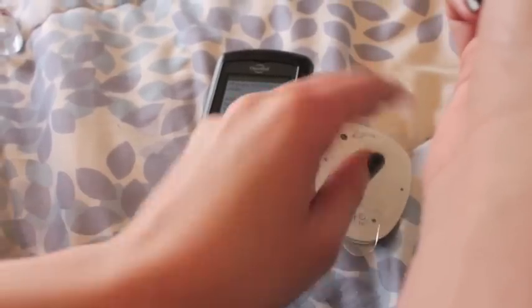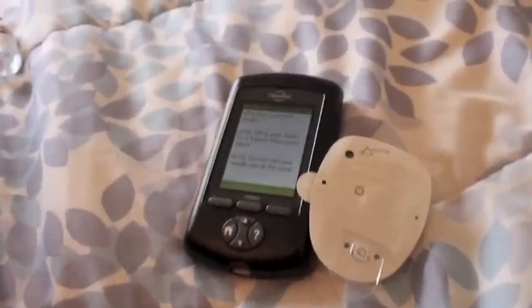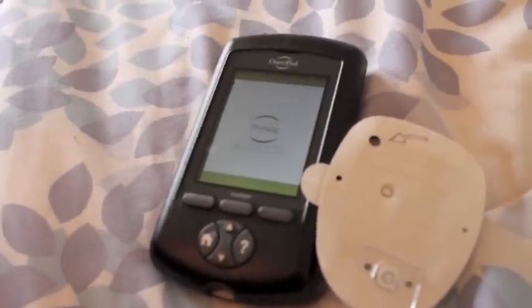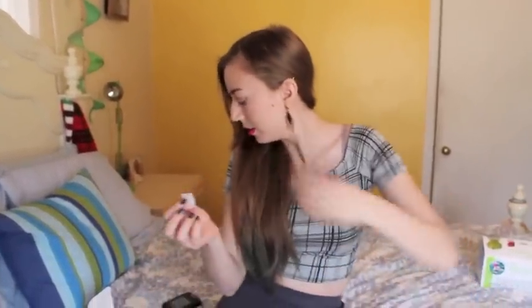So it beeped. I'm going to press next, and it's going to start priming and getting all of those little bubbles out. So in preparation, I'm going to get this alcohol swab, and actually my pod just beeped to let me know that it's done priming, so I'm going to try to hurry.